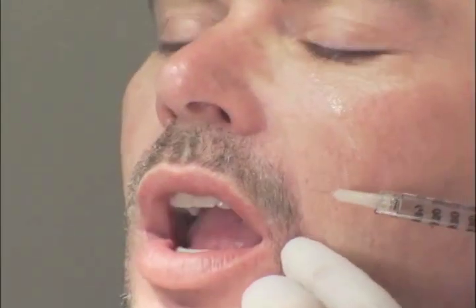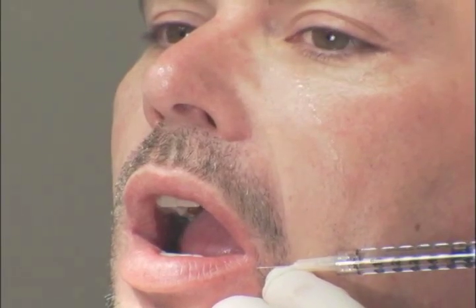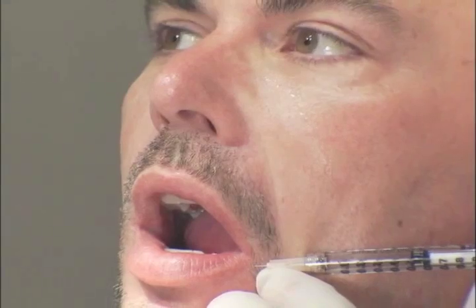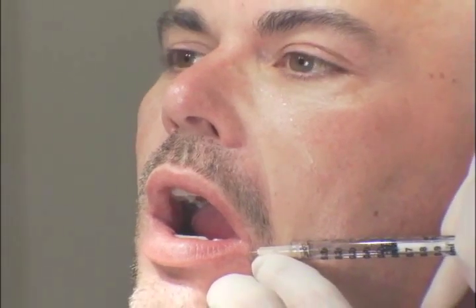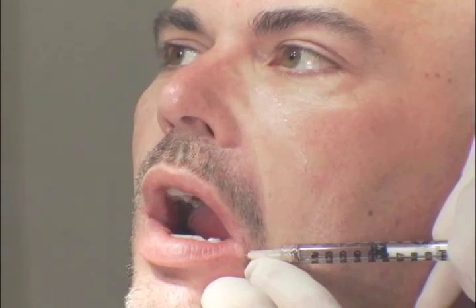Open your mouth for 1 second. We want to do the end of his lips to re-support his mouth. So bear with me for 1 second. We drop into the lip, and we restore the end of his lips right there. You see that restoration right here? You see that flow along the potential space of his lips right there.